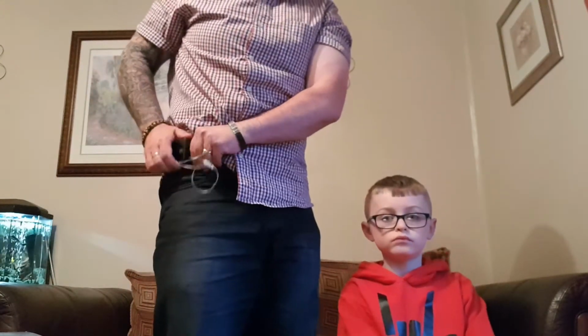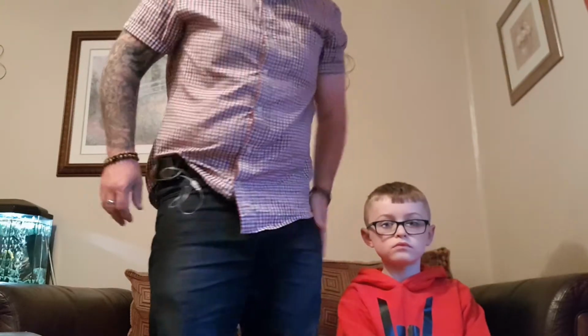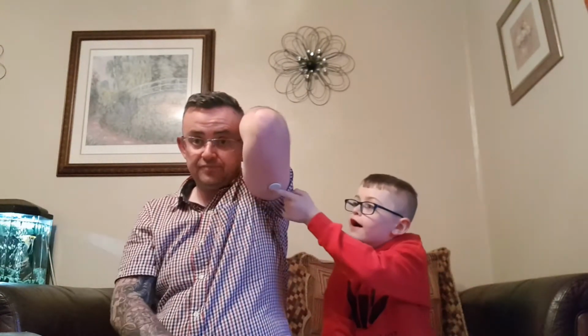I always like to check my blood glucose with the Libre. That's been changed this afternoon, so it's quite accurate at the minute. I use my phone to check it, so I won't be able to do that until afterwards.